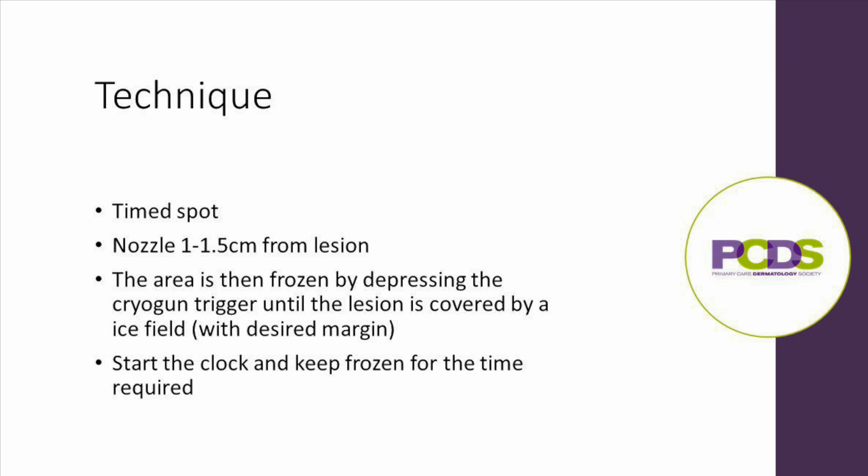Once the cryogun is ready and the lesion has been identified, you hold it 1 to 1.5cm away from the lesion and press the trigger on the cryogun until you have a consistent ice field covering the lesion with the margin desired for treatment, which is summarised in our treatment table.